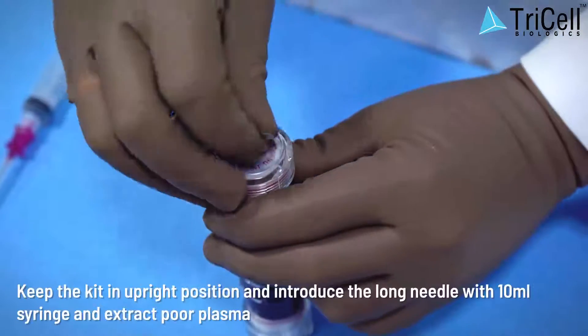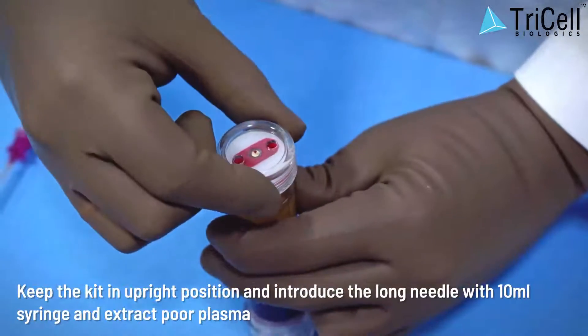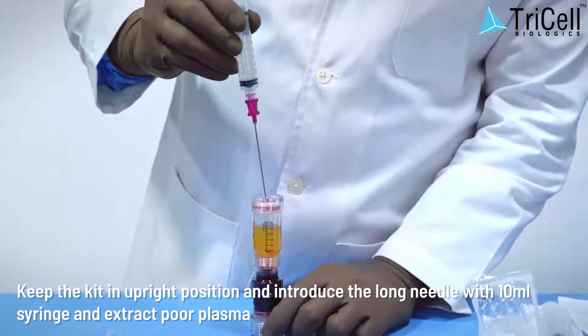Step 9: Keep the kit in an upright position and introduce the long needle with a 10 ml syringe and extract the poor plasma.